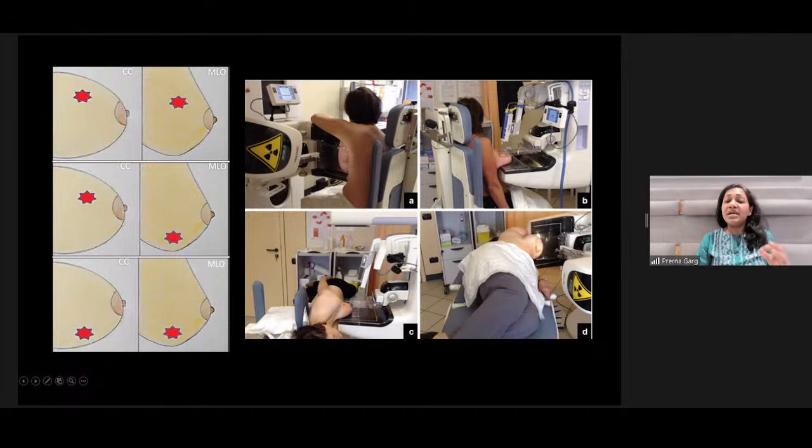So we need to be in sync with our surgeons before placing the wires, because you might have a skin entry site in Tokyo and the lesion in London, and it's all very confusing then. So we need to make sure that we know where the skin incision is going to be, and that the entry site is as close to the lesion as possible.